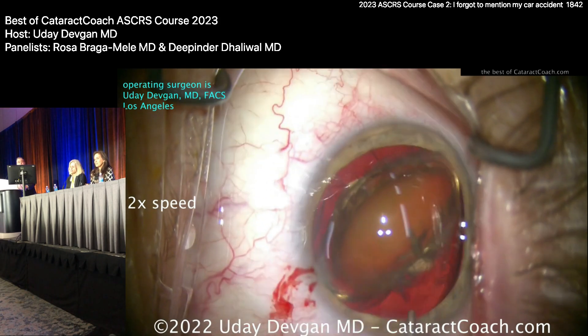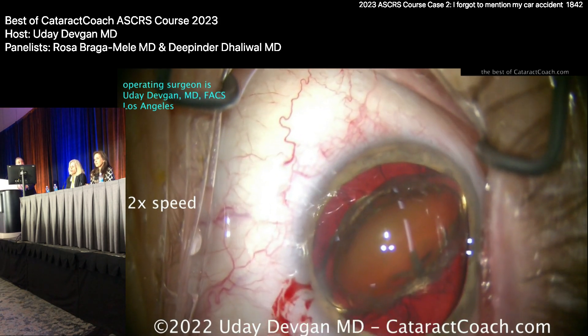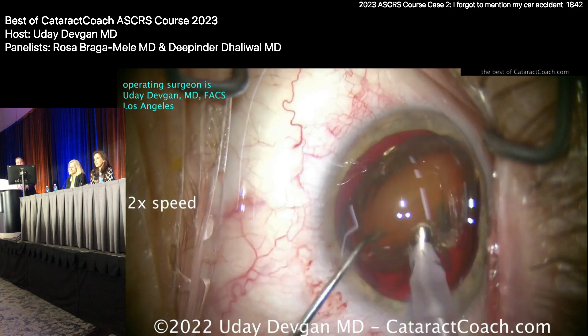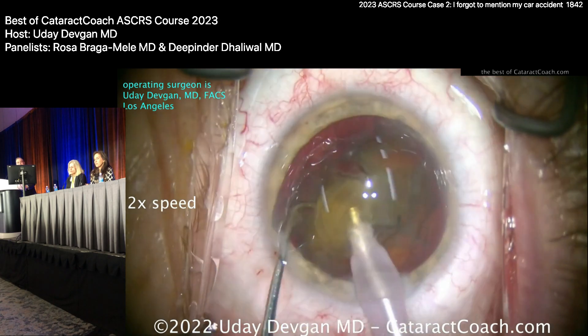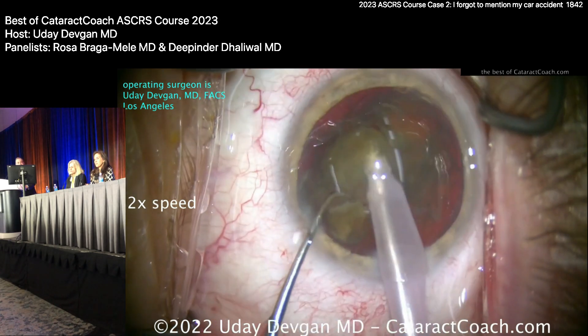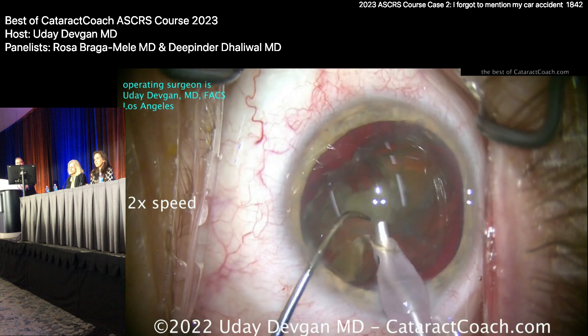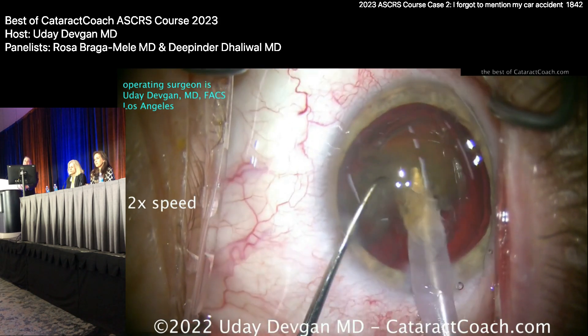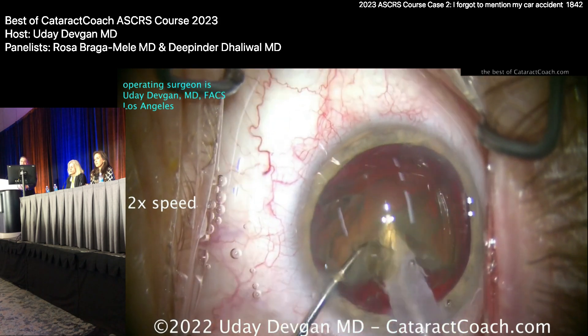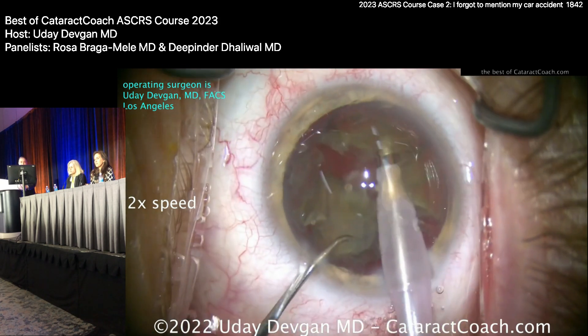It actually has some density — don't make fun of Beverly Hills cataracts. There are the two halves; chop it up. I'll stay at the iris plane — we're good buddies. Taking it down now; obviously the nucleus moves. The easy part is done since it's already out of the bag. The hard part is going to be cortex removal.